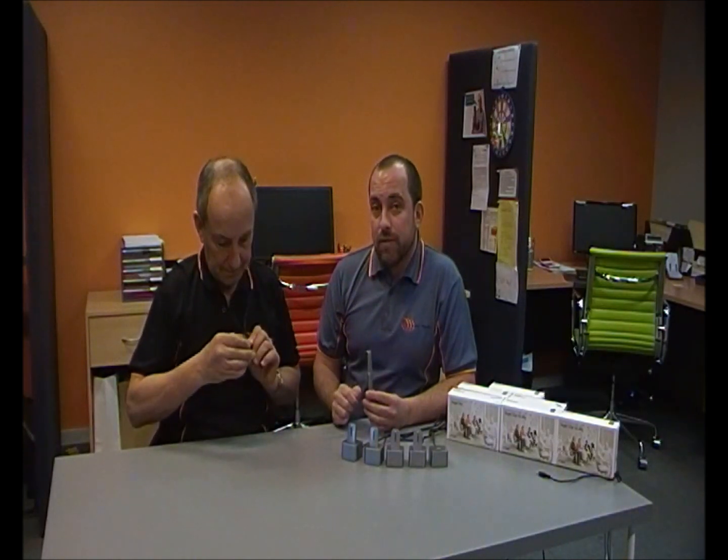We've explained how to use the Roger pen with the MyLink receiver. We can expand on the functionality of this system by adding a number of additional microphones to what we call the multi-talker network. Now to set that up, it is pretty simple. First of all, I'm going to ask Bob to turn off his MyLink receiver.